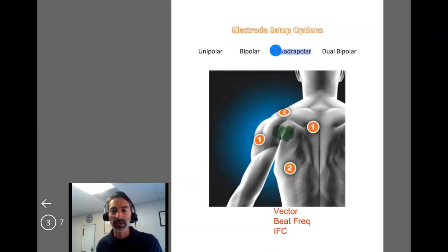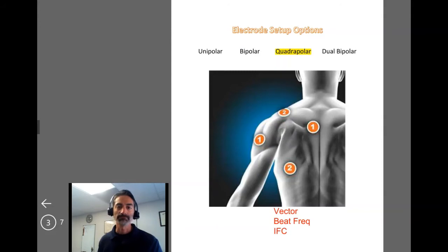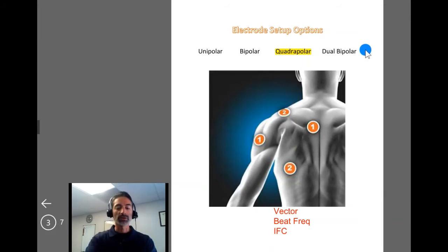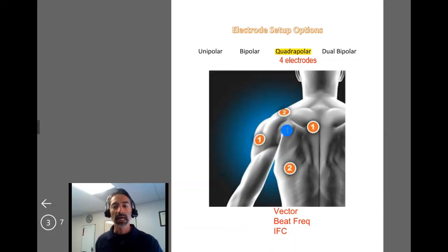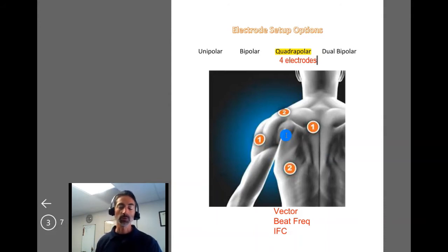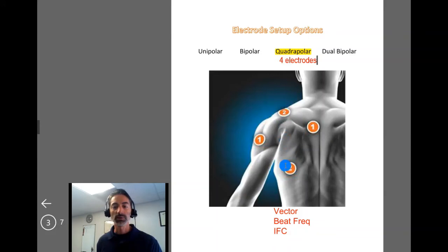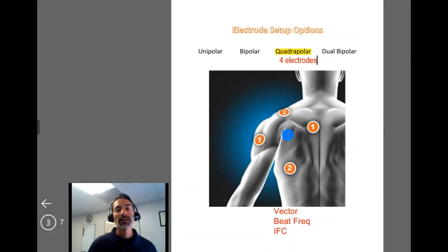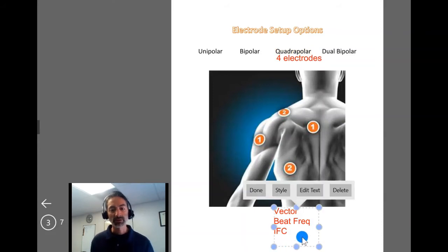This is a quadrupolar setup. A quadrupolar setup always involves — as the name implies — four electrodes. The treatment location is where those two channels intersect. The current is delivered in alternating current, bouncing between the two electrodes in channel one and between the two electrodes in channel two. This quadrupolar setup is most associated with IFC.